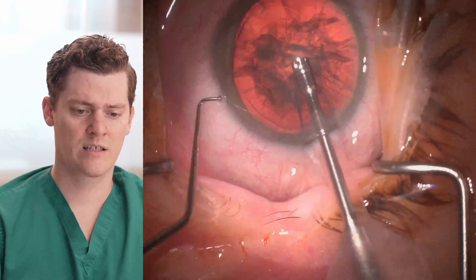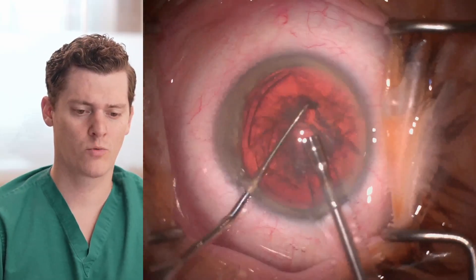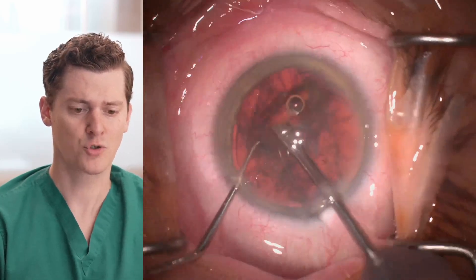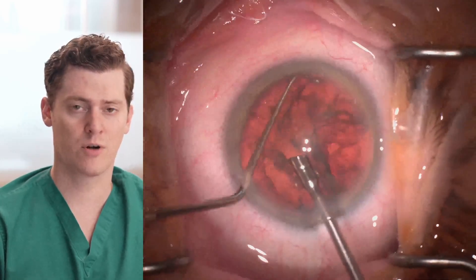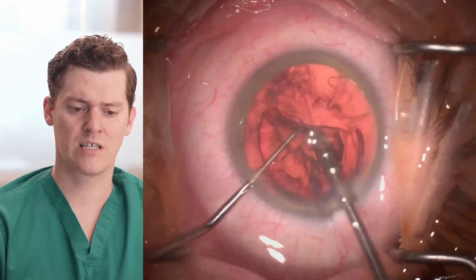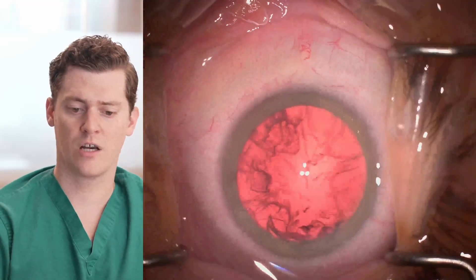During the rest of this case, I'm going to show it in fast-forward, showing phacoemulsification with horizontal chop technique, trying to reduce the pressure on zonules and the capsule while getting this lens out. And you can see that this goes uneventfully.